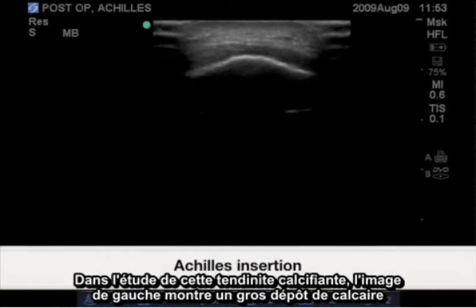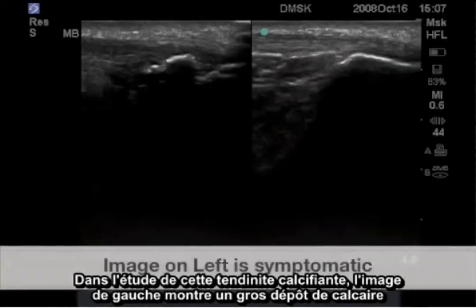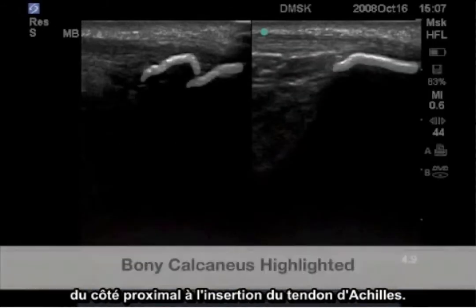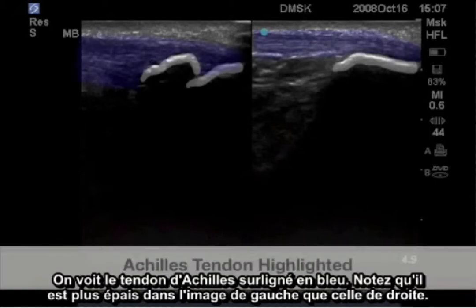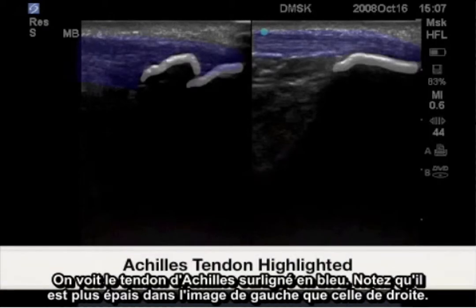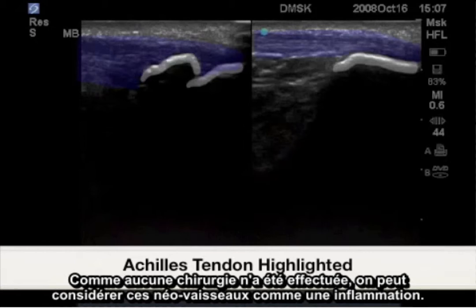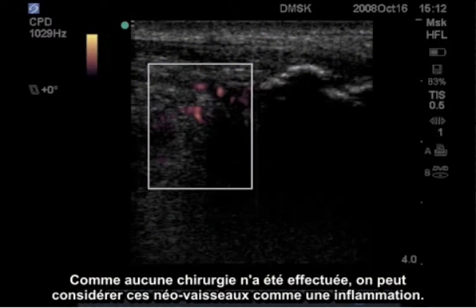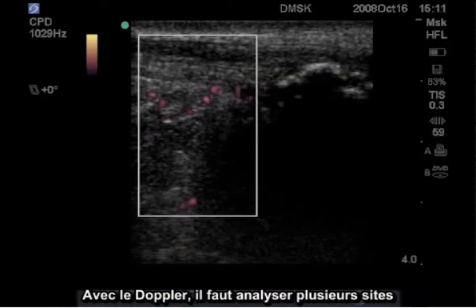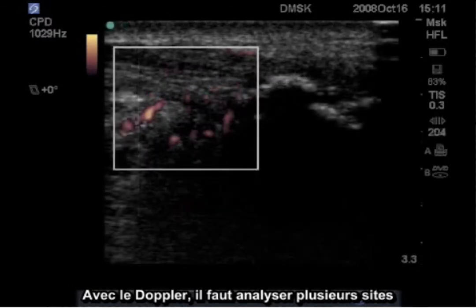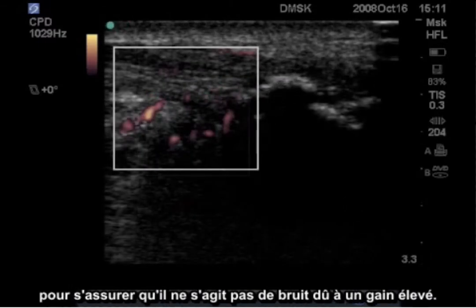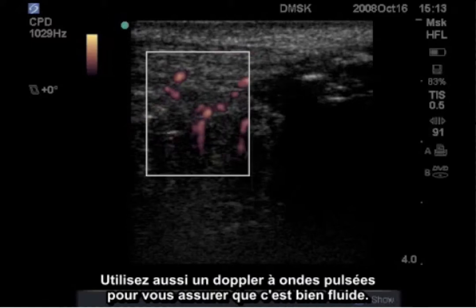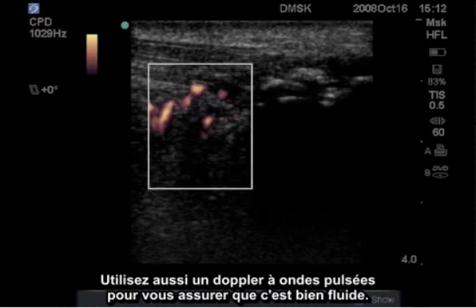In this calcific tendonitis study, the image on the left shows a large calculus deposit proximal to the insertion of the Achilles tendon, highlighted in blue, with the Achilles tendon noted thicker on the left image than the right. As there has been no surgery, these neo-vessels can be considered indicative of an inflammatory process. When utilizing Doppler, multiple sites should be sampled to ensure that this is not noise due to high gain. Also use pulse wave Doppler to ensure that this is truly flow.